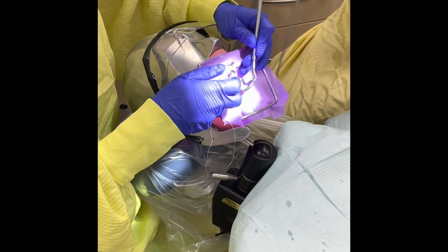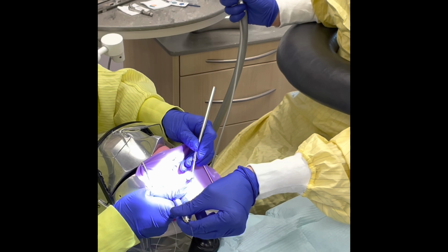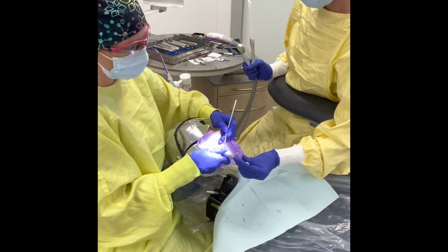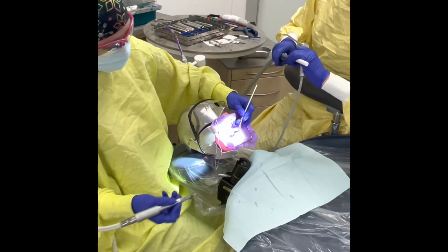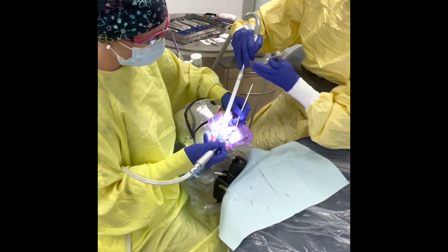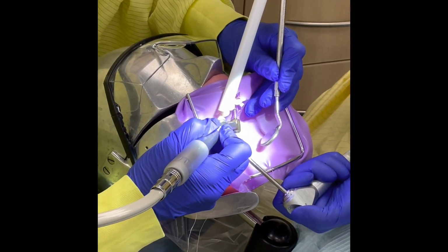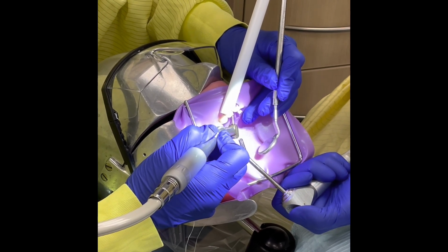They will then, I'm going to request an explorer, please, through the transfer zone. Thank you, Stacy. Good. Okay, and we will continue on. This time I'm going to go in with my low speed hand piece. So Stacy's going to again place her suction. With the low speed, you want to come in and blow intermittent puffs of air into the preparation.